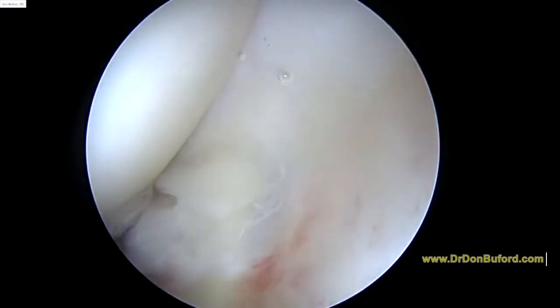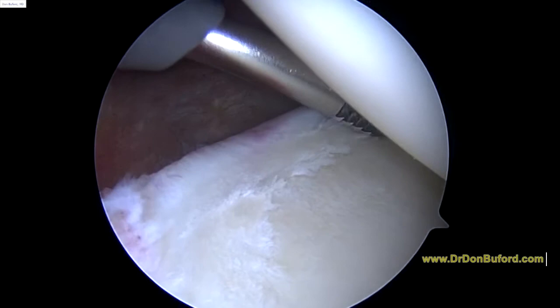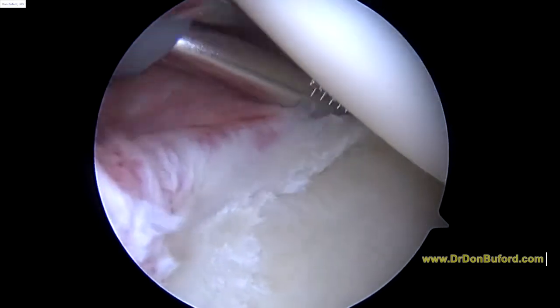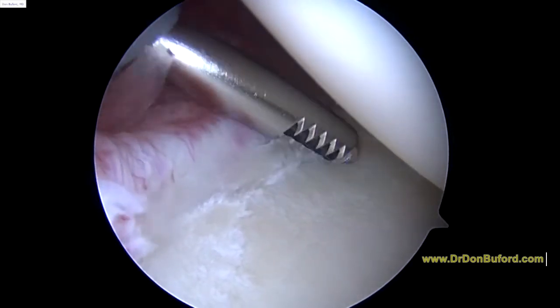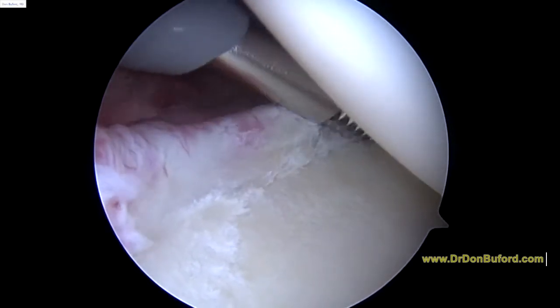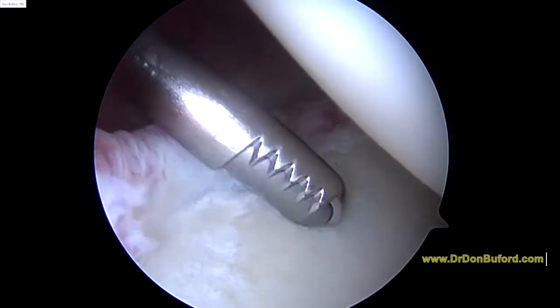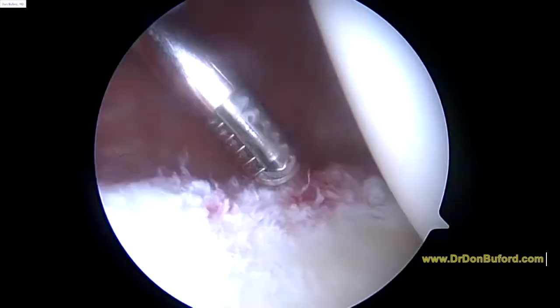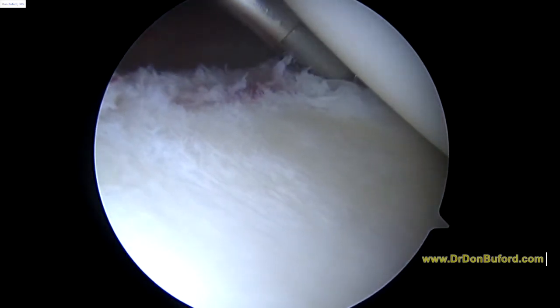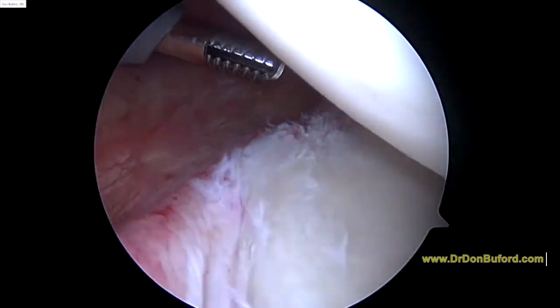Here is the rotator cuff. So we're looking towards the back — here's this little tear in the labrum that we're going to smooth out. It doesn't need to be reattached; it's smoothed out here. I'm taking out the little part of the labrum that was frayed. I don't think we really need to do anything else back here, so we'll stop. The joint capsule looks great, and there was no instability on the exam, so we're going to stop right there.